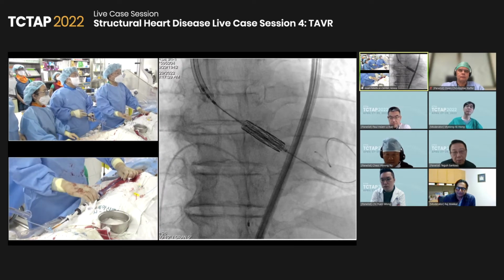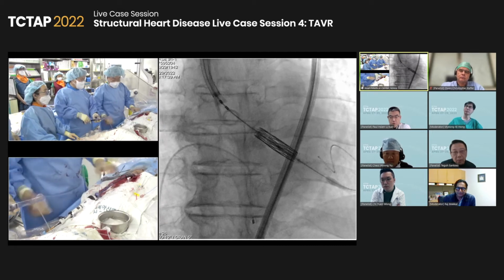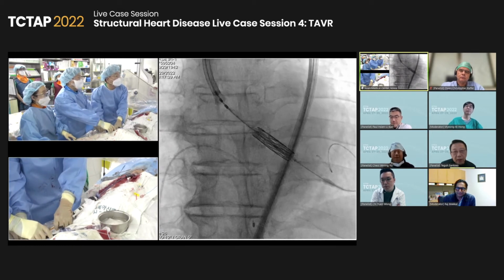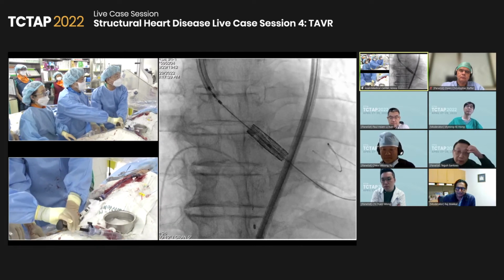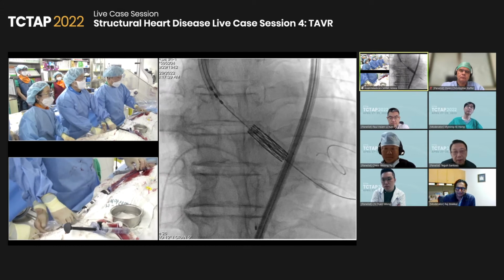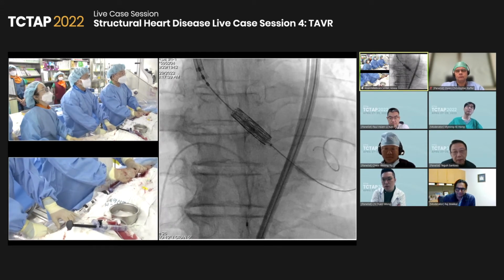Test, please. Test. Okay. Too much? Down. Just push the wire. Okay. I think it's okay. Test again.